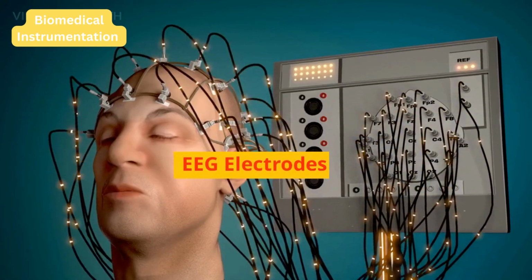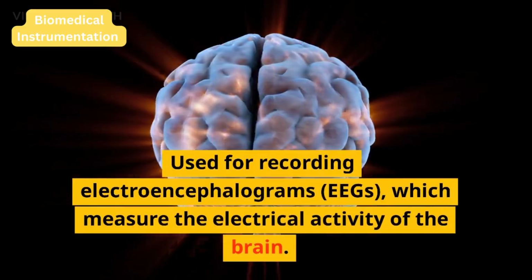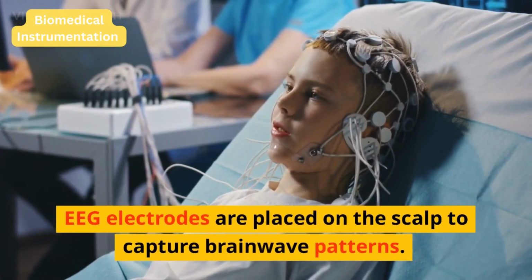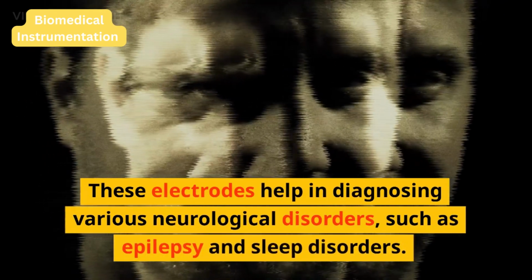EEG electrodes. Used for recording electroencephalograms, EEGs, which measure the electrical activity of the brain. EEG electrodes are placed on the scalp to capture brainwave patterns. These electrodes help in diagnosing various neurological disorders, such as epilepsy and sleep disorders.